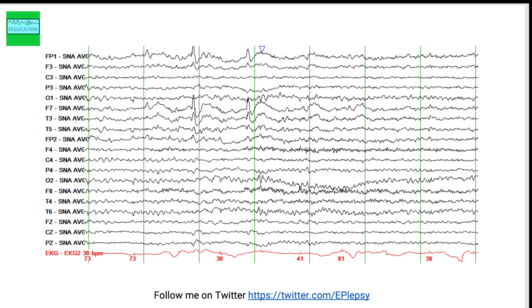This is another patient. The EEG is being reviewed in a referential montage. The most striking findings are sharp wave discharges in the left temporal as well as the left frontal head region. The highest amplitude appears to be in the F7 head region, which is the anterior temporal or posterior frontal area. At the same time, you see asymmetric slowing delta activity in the left hemisphere — both left temporal and left frontal. So this is an abnormal EEG secondary to asymmetric slowing and sharp waves in the left frontal temporal head region.